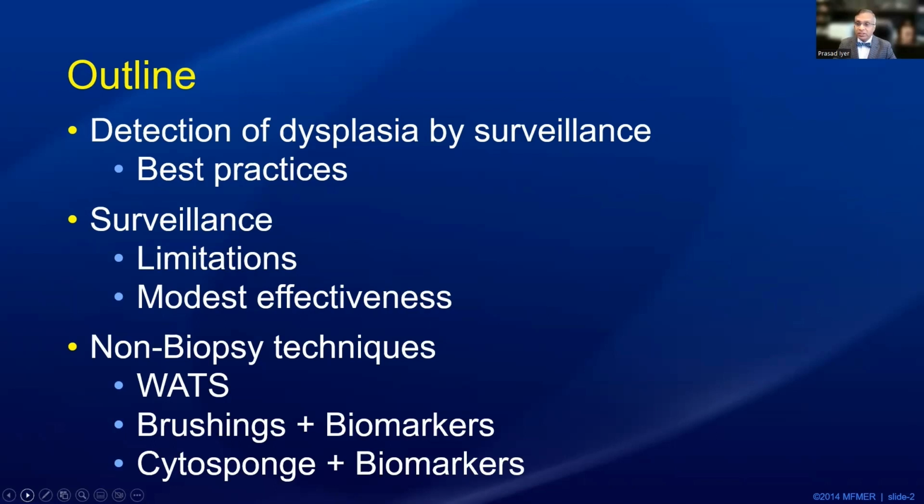And we will finish with some recent provocative data using a combination of sampling the Barrett's mucosa with a cell collection device like the Cytosponge in combination with biomarkers, both histopathological as well as clinical biomarkers.